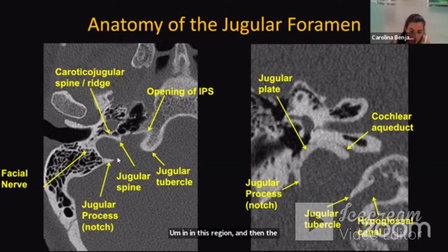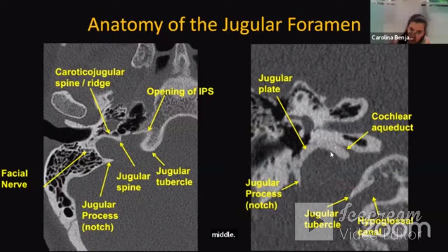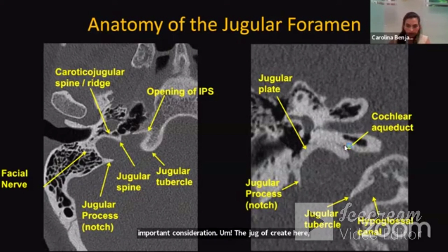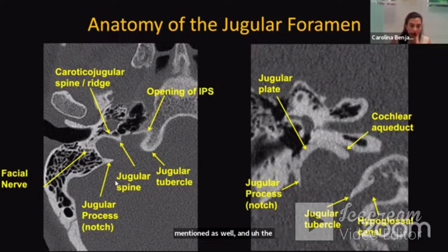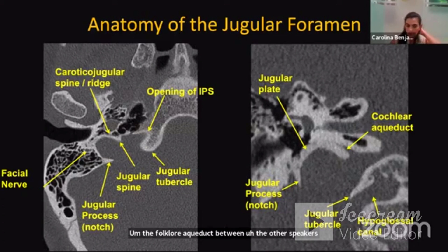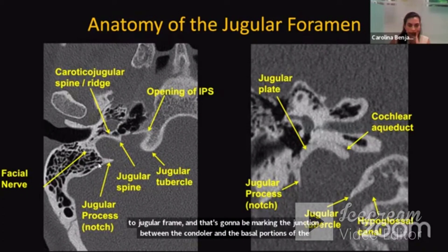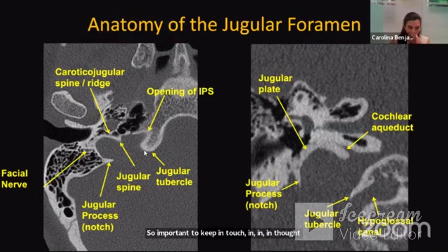The jugular plate separates the jugular bulb from the middle ear canal — an important consideration visible on CT imaging. We can also see the cochlear aqueduct on these images. The jugular tubercle is medial to the jugular foramen, marking the junction between the condylar and basal portions of the occipital bone. It's important to keep in mind the jugular process, jugular spine, and jugular tubercle as key bony landmarks when assessing how pathology is eroding these structures.